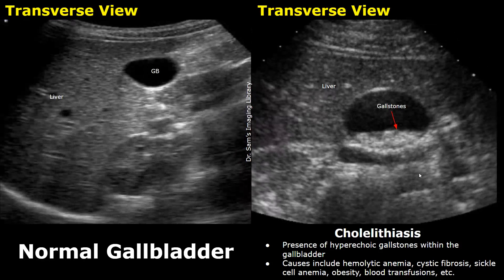This is a transverse view of the normal gallbladder. Here is a transverse view showing gallstones — hyperechoic stones are seen within the gallbladder.